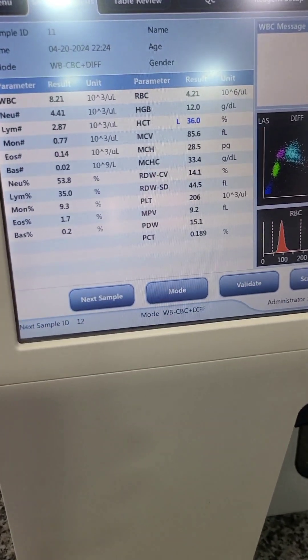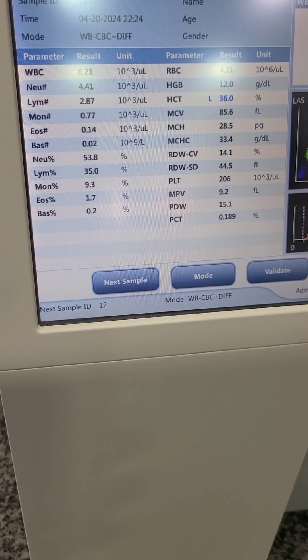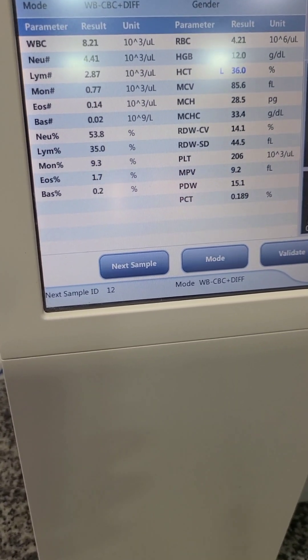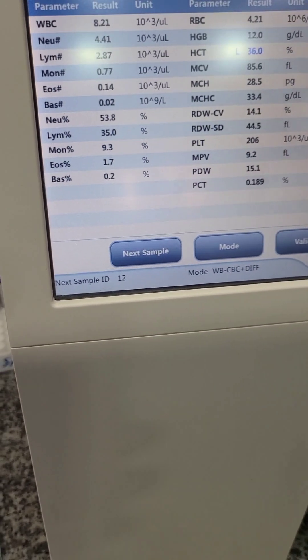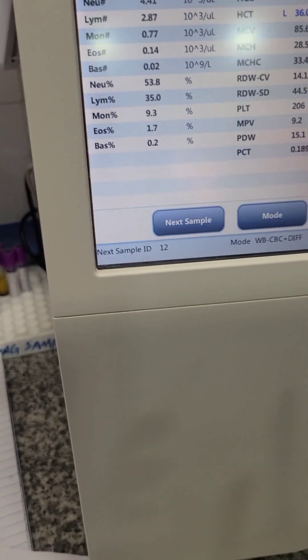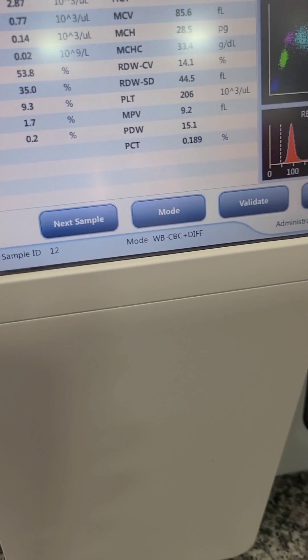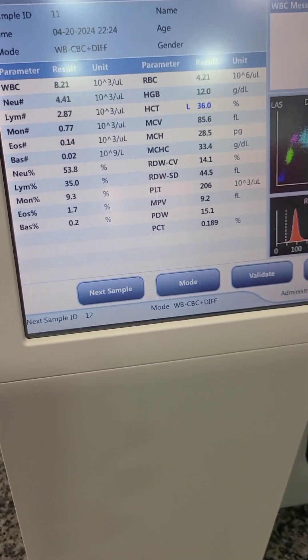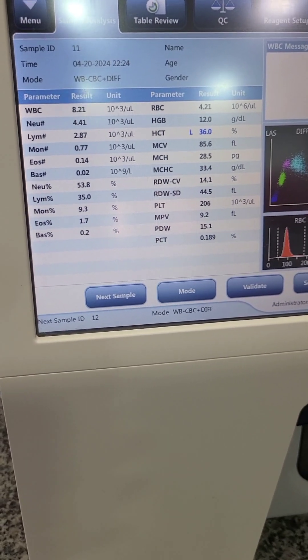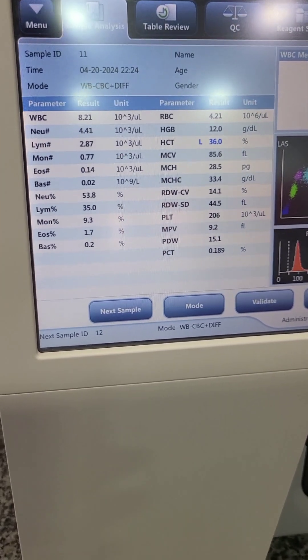As you can see, the results are displayed. It shows the WBC count — the total white blood cells — and the different components: neutrophils, lymphocytes, monocytes, eosinophils, both granulocytes and agranulocytes. It also shows the platelet count, and you can know the blood level from the HCT and the hemoglobin level. These parameters give a picture of the patient's clinical condition, helping the doctor arrive at a diagnosis.